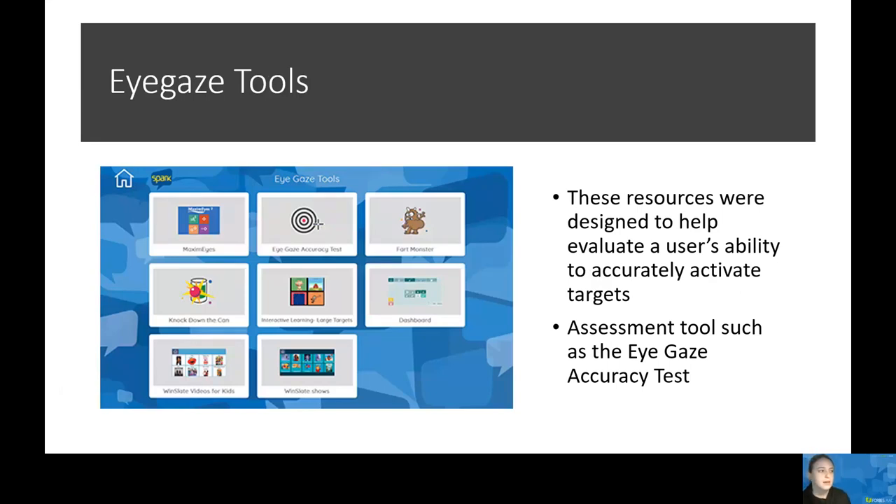Next, I want to talk about the eye gaze tools that come with Spark. First, we have MaximEyes. This is a set of MindExpress activities that engage and motivate users as they discover eye gaze and eye interaction. It teaches users how to focus on a single target, then moves them to choosing between multiple targets and building up skills in selecting moving objects. It can be really interactive for AAC users just learning eye gaze, especially kids — they can tickle a penguin to make it laugh, grow flowers with their eyes, and look to see what's hiding beneath a pile of leaves. From a clinician standpoint, a heat map can be created showing the areas the user was focused on.